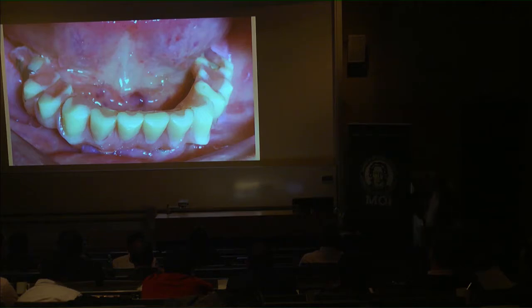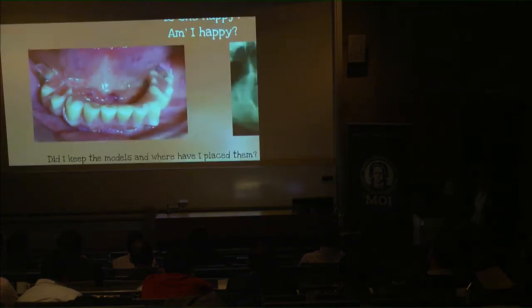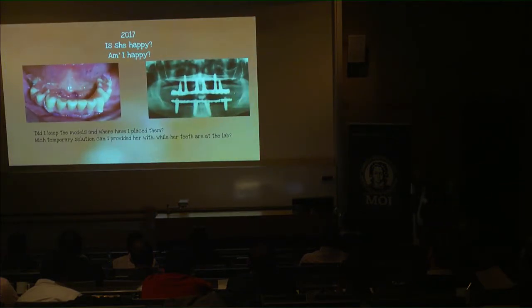That's not ideal. She came because she fractured these. Of course, she should have been provided with a splint many years ago, or 3 or 5 years ago, had the opportunity to get new acrylic teeth on the framework. I'm happy with the bone level, though. But it opens a lot of questions for me. Did I keep the models, and where are they? How do I temporize her while I fix the bridge? Can I use the framework again? Blah, blah, blah. Not easy.